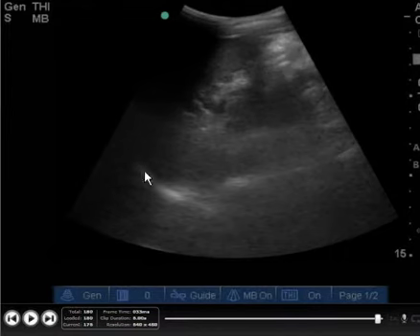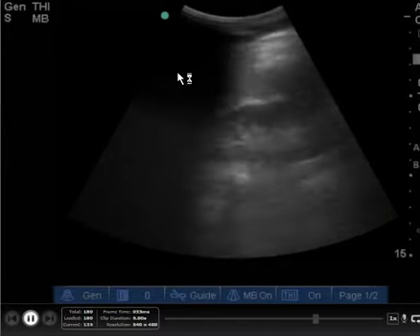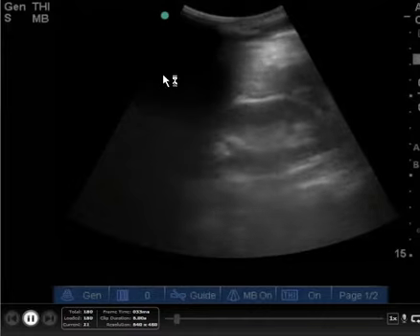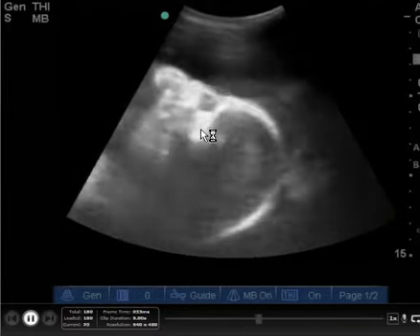This part here, the spleno-diaphragmatic space, is the more sensitive area for free fluids, so very important that you get this in view. You do catch it, which is good enough to meet the criteria. And then same thing here. Again, I just wanted to point out that this whole dark area is the fact that there's no contact with the patient. And the final thing to go over is just the suprapubic view.